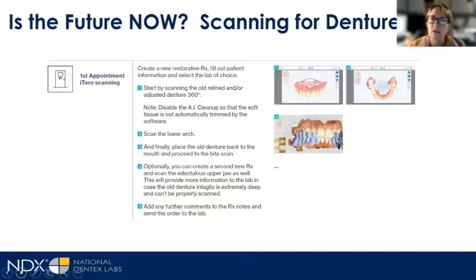So some of the key things that you want to be aware of, and this is snippets from a document that is being sent to you as a follow-up from today's presentation, and it comes from Align Technologies. There's two different recommendations or schools of thought when it comes to fully edentulous scanning. One is to scan the denture itself with a wash impression or a chairside reline material inside of the denture. So you're going to scan the occlusal surfaces of those denture teeth and the intaglio of the denture. The tricky part is capturing all of the border molding that you've done with that wash impression, right? To capture the muscles that you would ordinarily get in your custom tray impression.